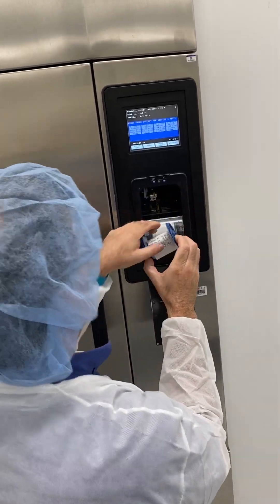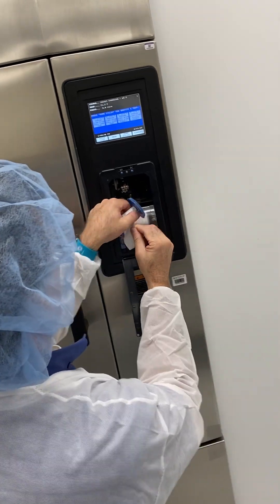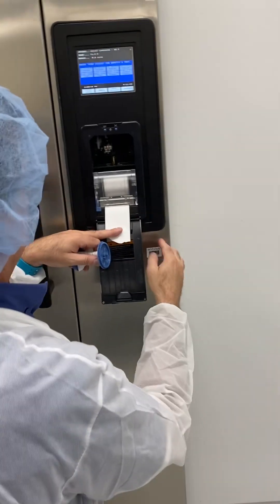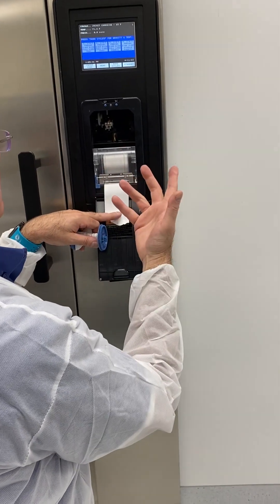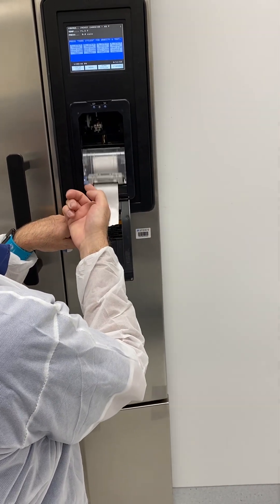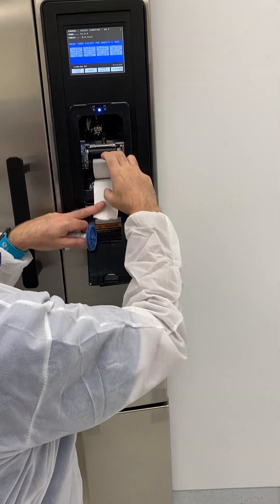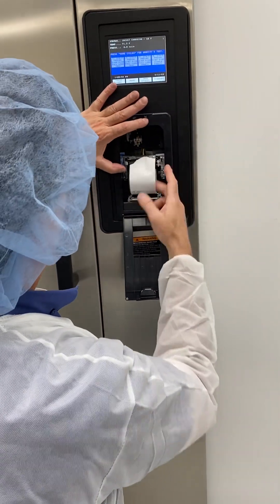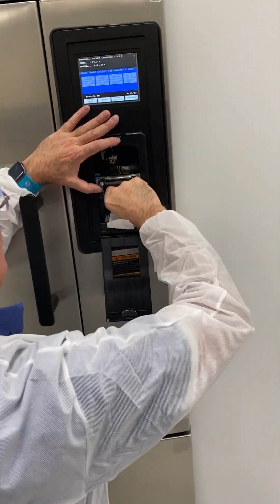I'm going to go ahead and undo that, and then we've got where the paper is right here. There's no ink ribbon, so all I'm going to do is lift this door — I'll lift the door and pull the paper out.